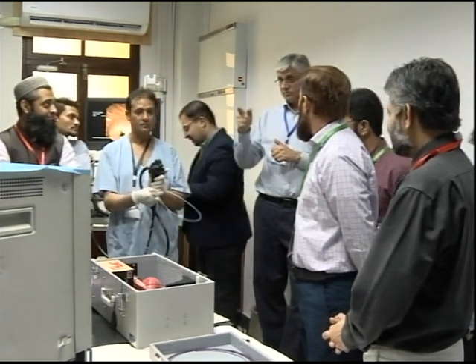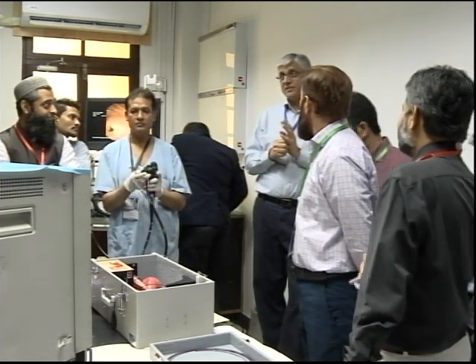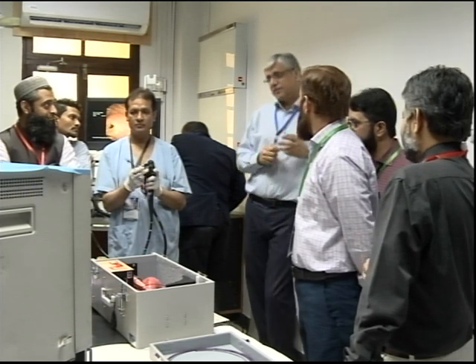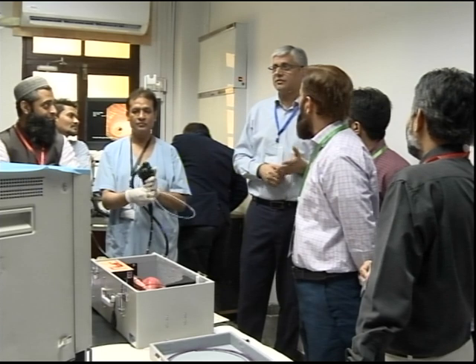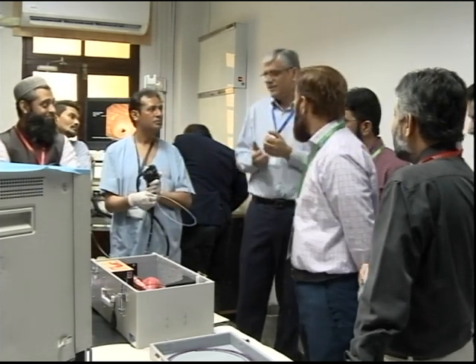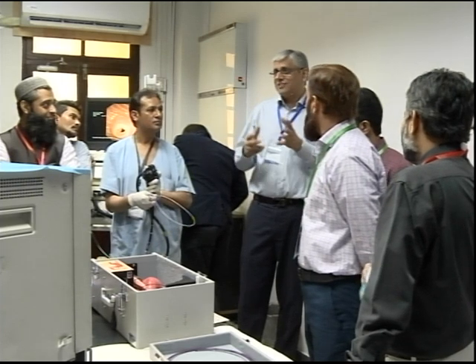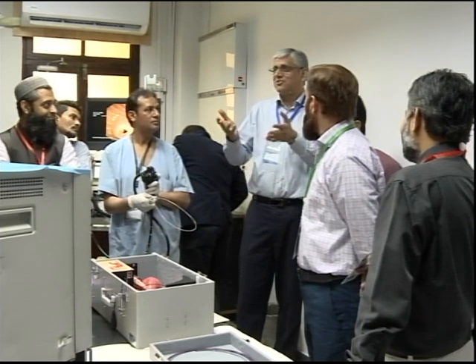One go in, otherwise leave the scope. So sometimes I would look at the ampulla and say, take the scope. Why didn't you try? I said, there's no point. I know I won't get it in one time. These ampullas are difficult ampullas and we are learning. But the advantage I had with the other one would leave. Keep trying. I said, no, I can't. I don't want to risk.